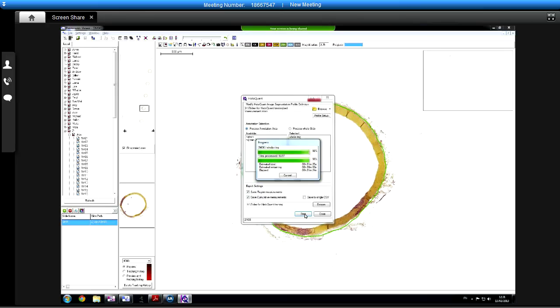When's it due for a service? It's one of those funny ones. In theory, there's not a service in the first year, but there's a service in the service contract, isn't there? We're still learning a little bit with the 250s as to how often, it depends how much use they get. There's not a great deal of service unless it starts going wrong. But it squeaks a bit when it's taking in the trays. I find they all make a slightly different noise. And it's sometimes when it takes in slides. It doesn't seem to relate to whether it works or not.